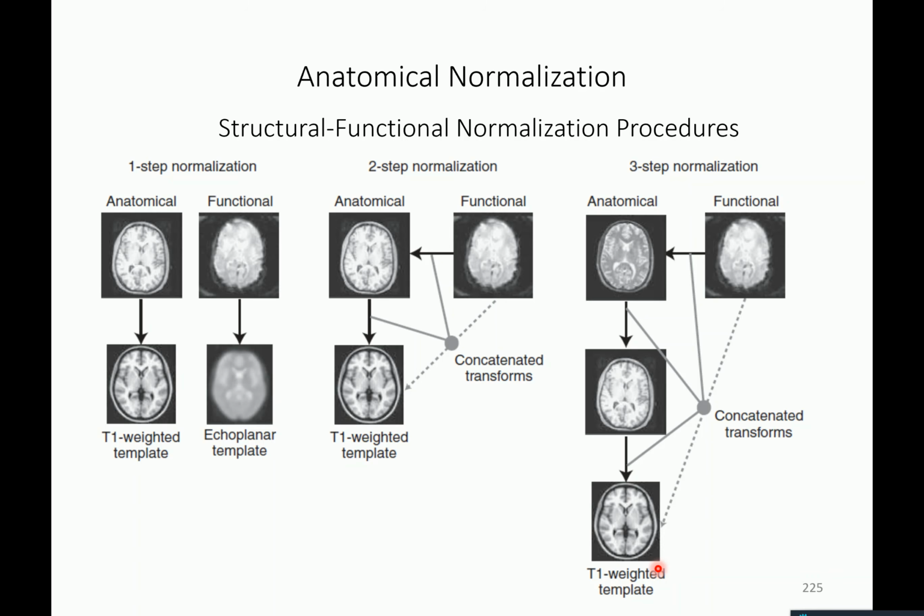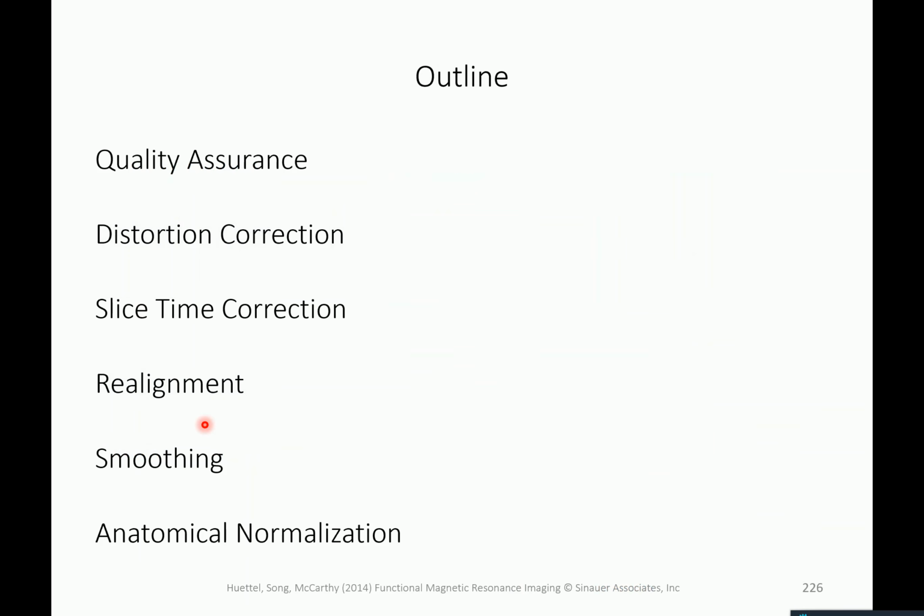The question still is, is that reasonable? Does one want to do that? Do different people actually have the same brain areas so that it makes sense? Or does everybody have their own brain, and you cannot really compare different brain areas? But this is how things are usually done in fMRI research for group studies, and that's called anatomical normalization based on MNI templates. So that was everything I wanted to say about preprocessing.